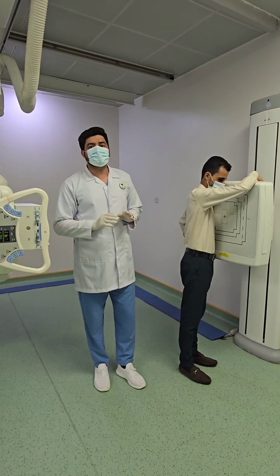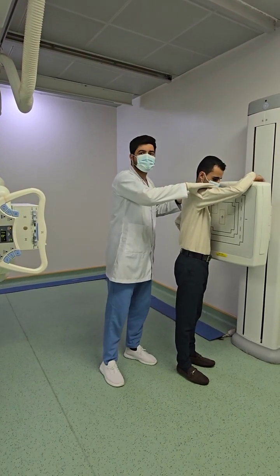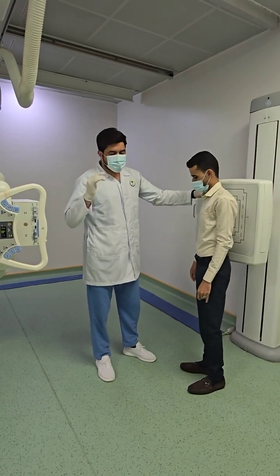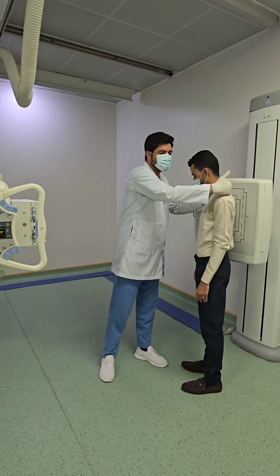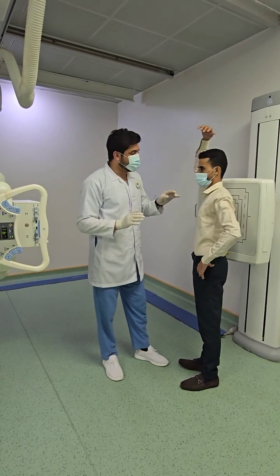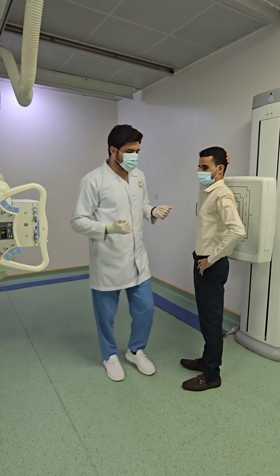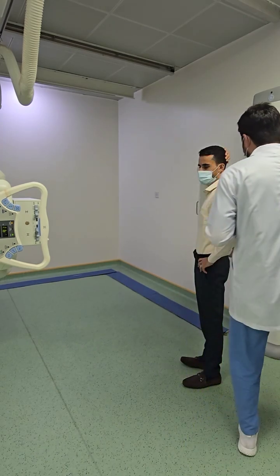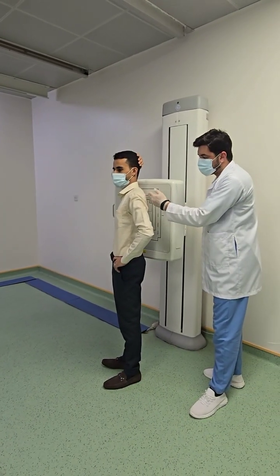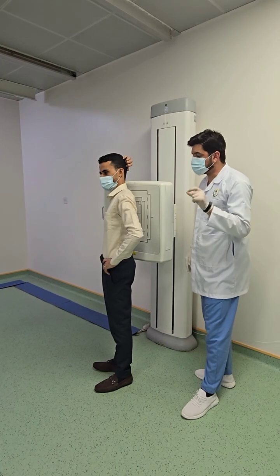Now we will go for the PA, posterior oblique. And the posterior oblique, as I told you before, the posterior aspect now is near to the detector. So in the oblique we will take the posterior side first, the side which is near to the detector. Now look over here. The posterior side is near to the detector. So P we will take first.